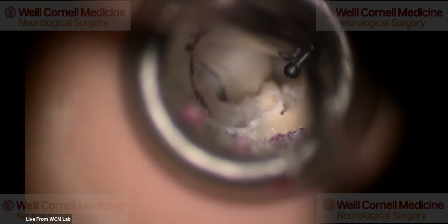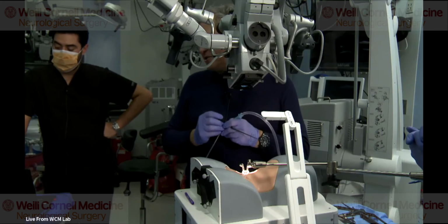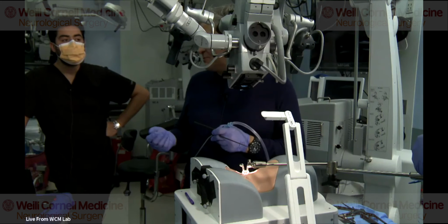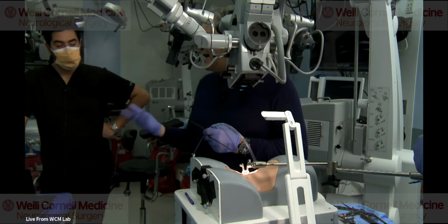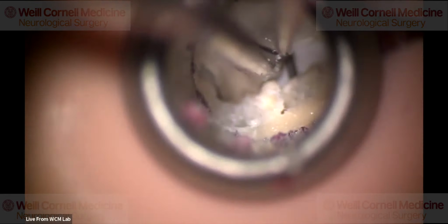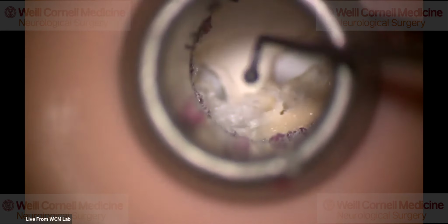So now the other thing that I do is I look at the preoperative MRI scan and I try to figure out where the nerve compression is in relationship to the medial border of the pedicle. Because sometimes the nerve compression is pretty medial and sometimes it's pretty lateral. And since we have the pedicle here now, we can orient ourselves. And then we know how far lateral we have to go for the decompression. You don't want to go too far lateral if you don't have to.